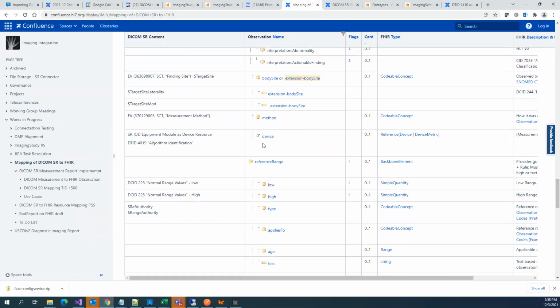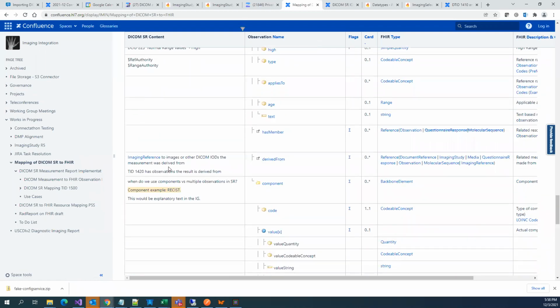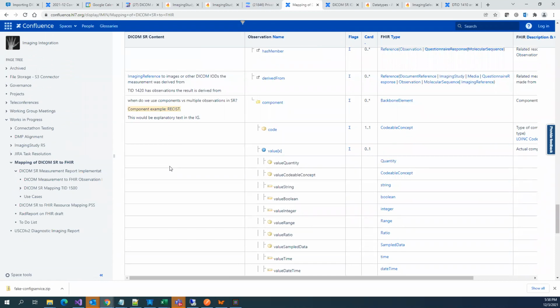We could also use it directly, but what I prefer is that for whatever DICOM web interface response we have, if you are able to map it there, then it is also easier to do it in the templates. We can just take that JSON path and put it on the template, and it should start working. So it is still at high level, which we can convert to DICOM web interfaces. That is one thing we will do over this period.